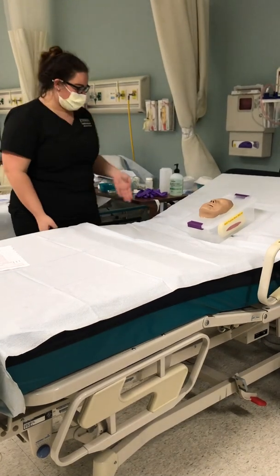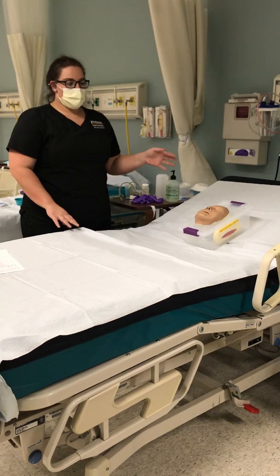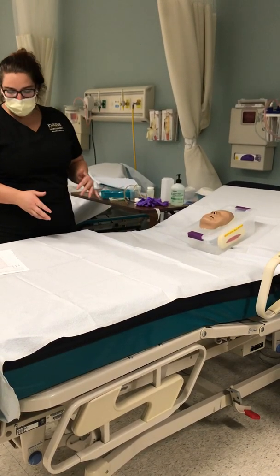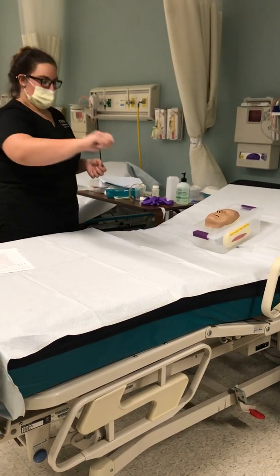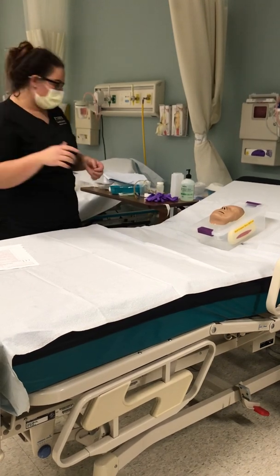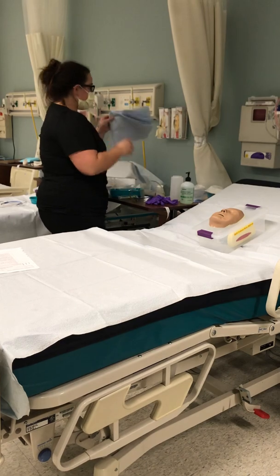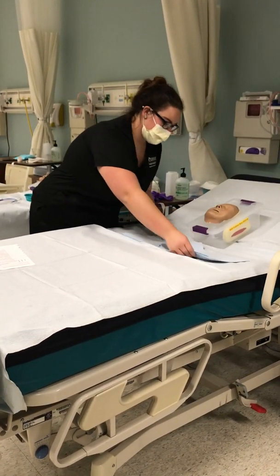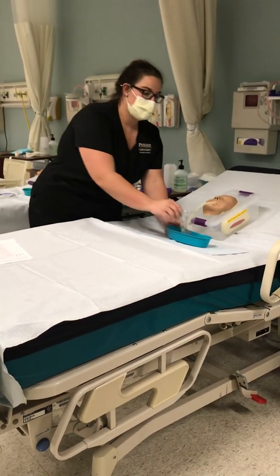I will make sure that the patient is in a comfortable position, upright, for the insertion. Inform them that this procedure might be a little uncomfortable. I will make sure that I close all the curtains, shut the door, so there's privacy. And then I would begin by placing this over the patient. As I place it over the patient, I'll also give them a basin and some water with a straw so it's accessible to them.